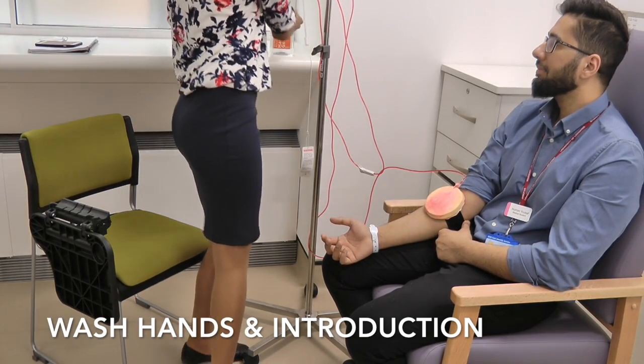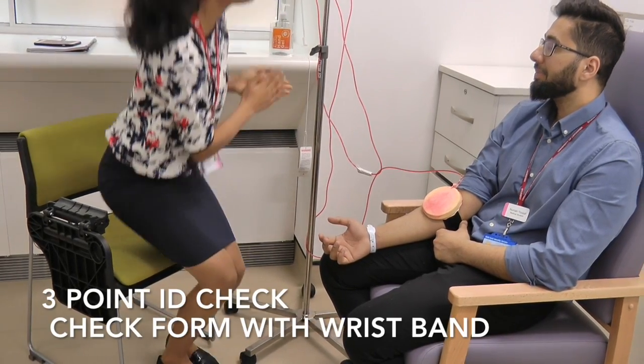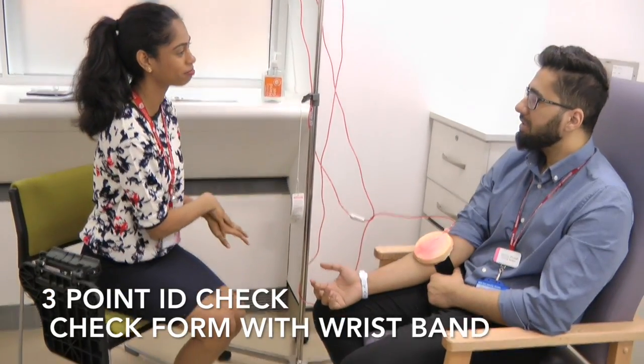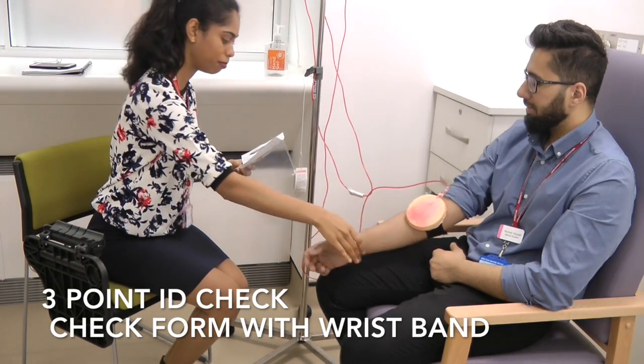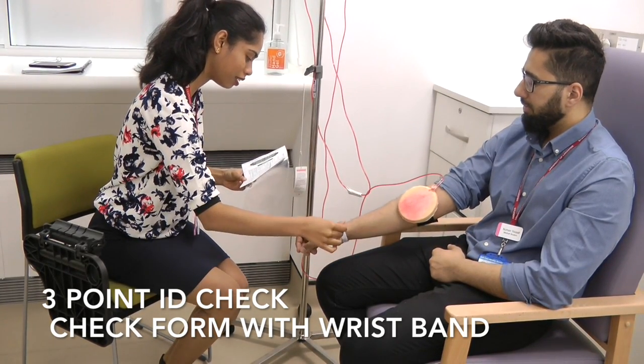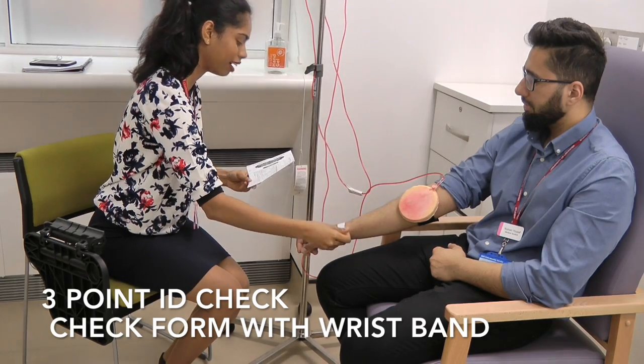Hello, my name is Chanel. I'm a fourth year medical student. Could I get a full name and date of birth, please? It's Neumann Yusuf, and it's 27/01. Could I just have a look at your band? Neumann Yusuf — just checking the ID number, and that's fine.